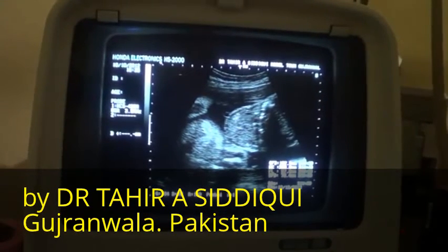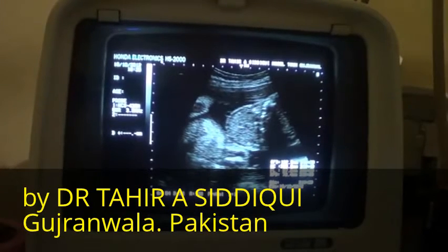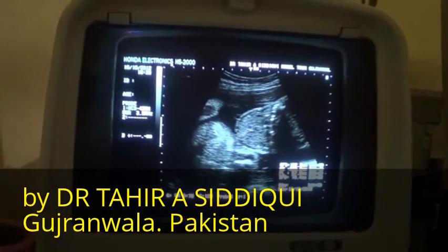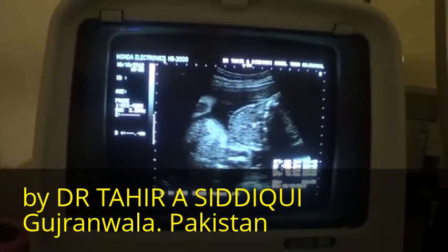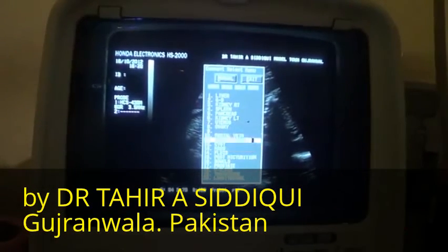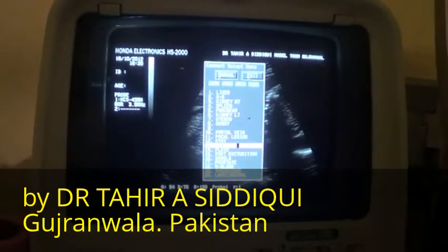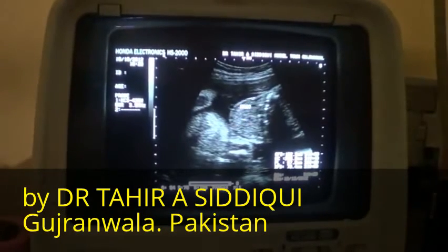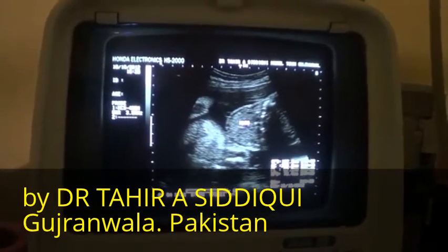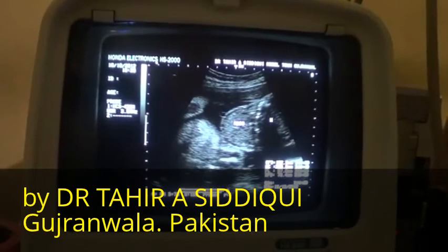So now this is the covering, and this is an evenly echogenic mass relating to the fetal neck region, that too anteriorly. The mass is anterior to the neck. This is the fetal head.